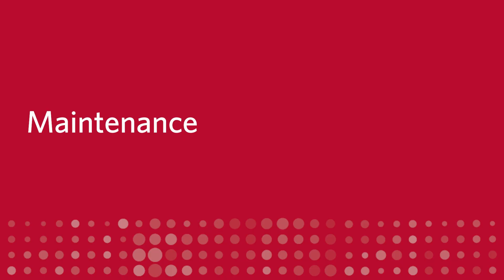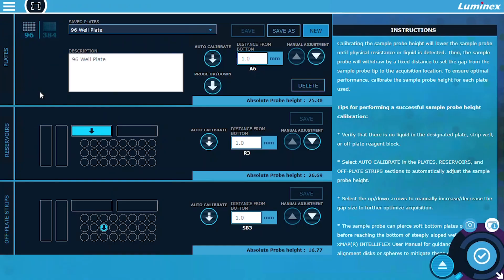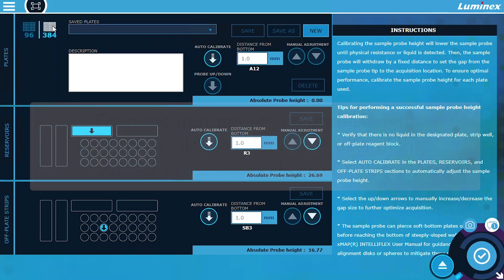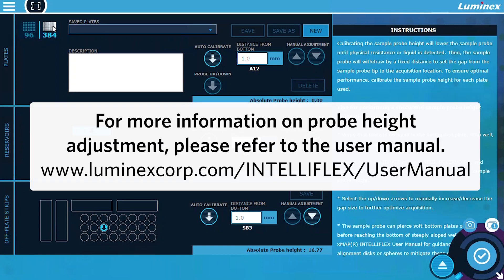Maintenance. Software Version 2.0 also introduces maintenance improvements. First, we've included an alternate method of performing a probe height adjustment for 384 well filter and mylar plates. For information on probe height adjustment, please refer to the user manual.